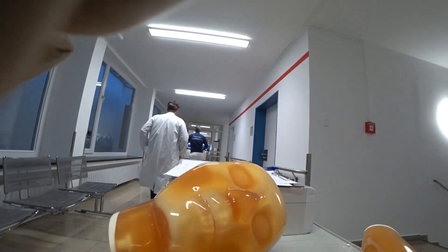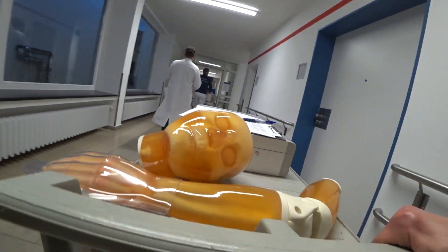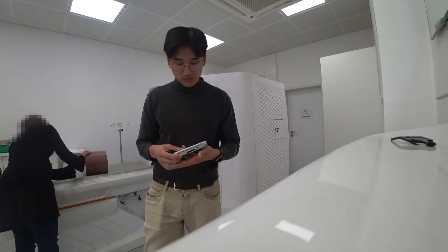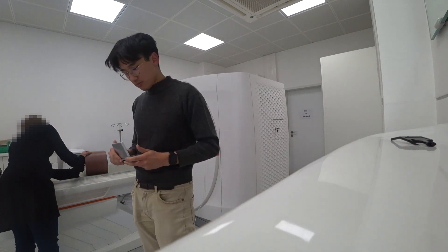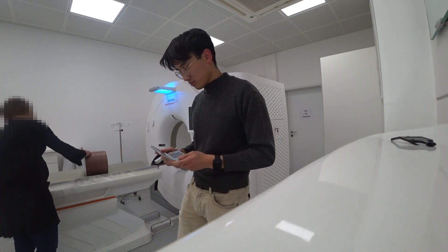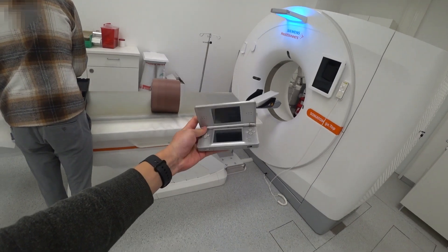As I study medical physics, I had to do some experiments with a clinical CT scanner, and I had this very unique opportunity to bring my own object to scan. So I couldn't let this one go.